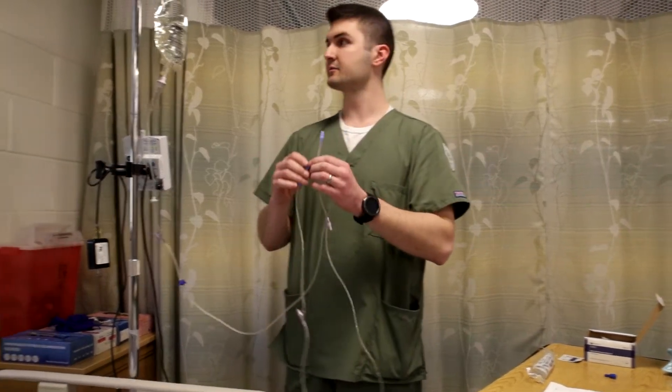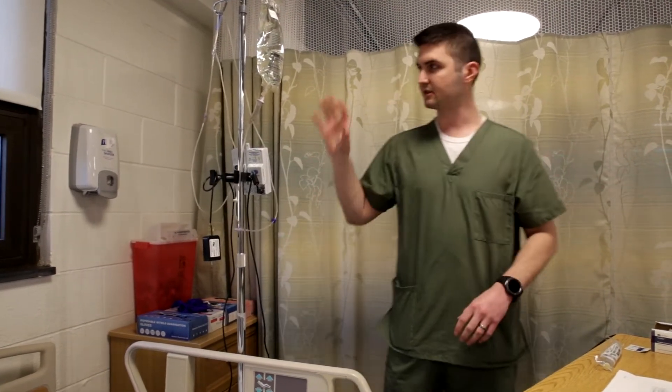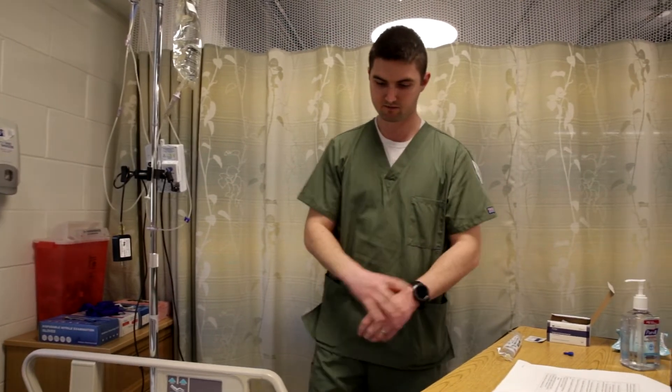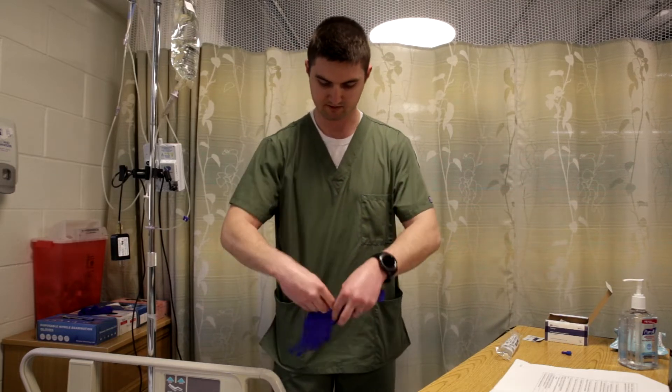So I have this clamped — this is ready to go now. I can hang this out of my way with this sterile tip on there still. Now that I have my IV fluids ready, I want to inspect my IV site. I'm going to look for any signs of infiltration, any redness, any signs of infection.